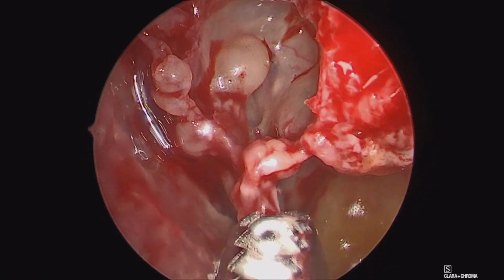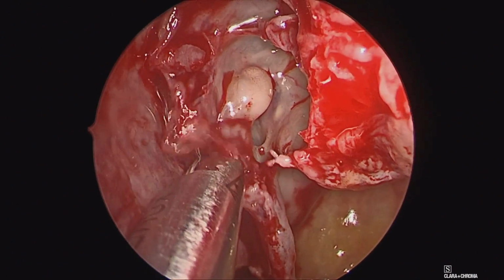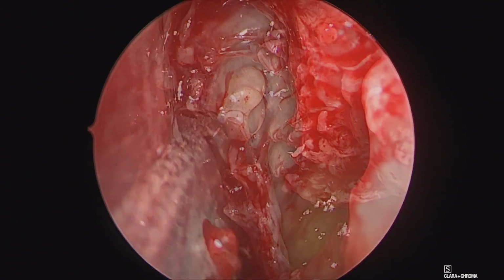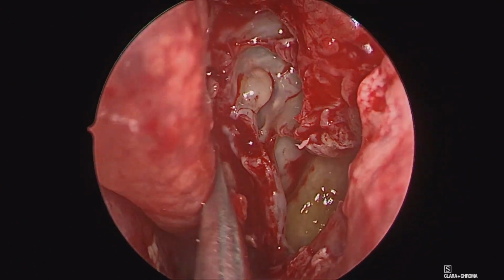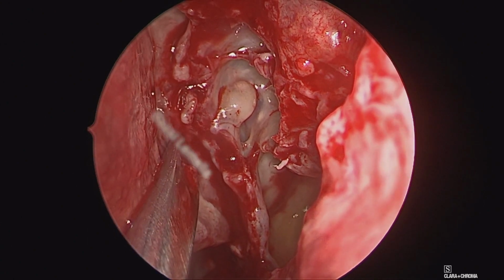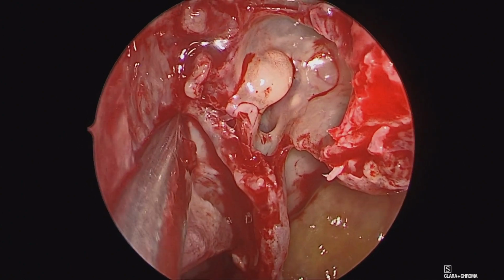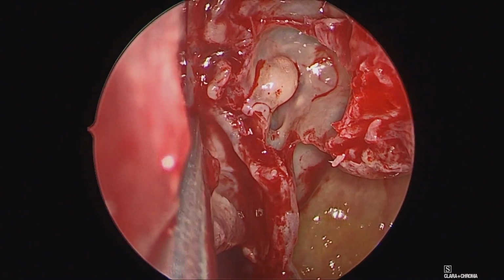As we continue to dissect through this area, removing the last bit of the medial part of the ethmoid bulla, you can see the basal lamella just behind us, as well as that lamina again lateral to us. Then we'll enter in through the basal lamella in an inferior and medial fashion in order to access the posterior ethmoid cavity and identify the superior turbinate just on the other side of this partition.